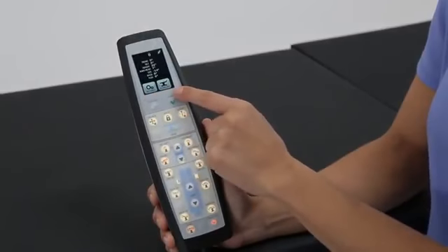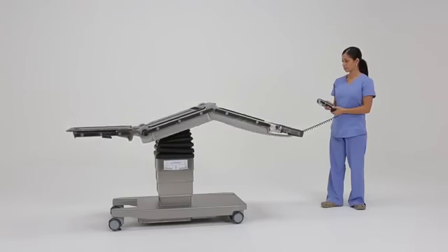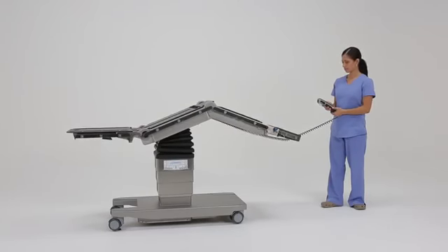Setting and positioning are displayed in the screen. The positioning feature holds 32 programmable positions that you can return to within one millimeter of tolerance.